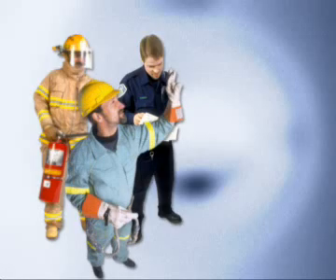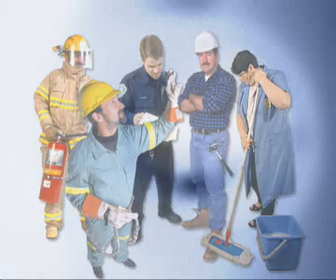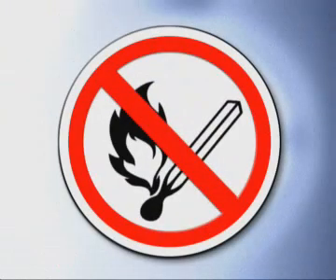Don't forget to brief persons such as rescue workers, firemen, workmen, and cleaning personnel who may be near the magnet for a short time only. In addition, inform personnel that smoking and open flames are not permitted in the vicinity of the magnet.